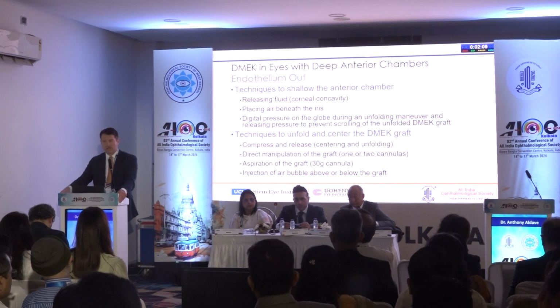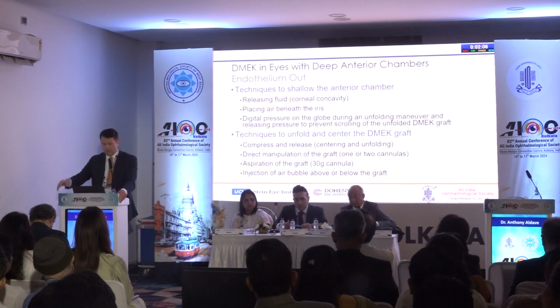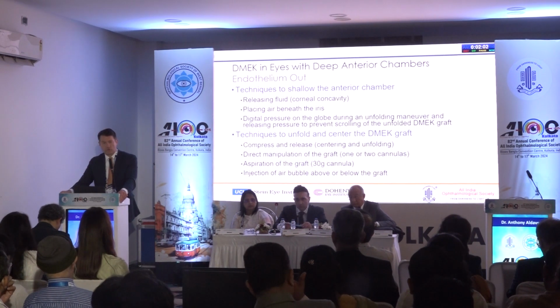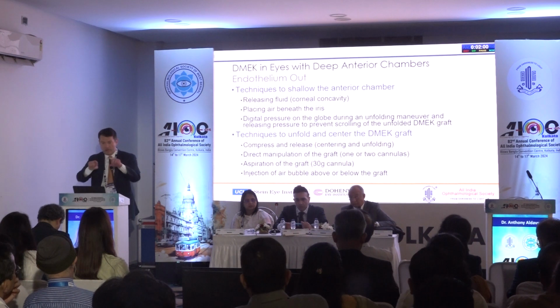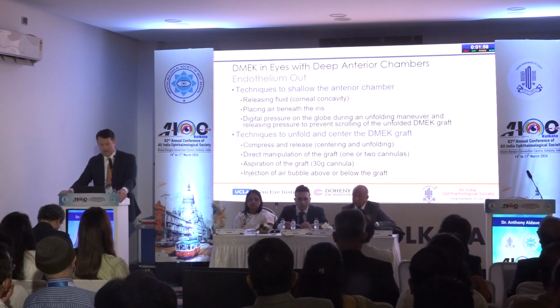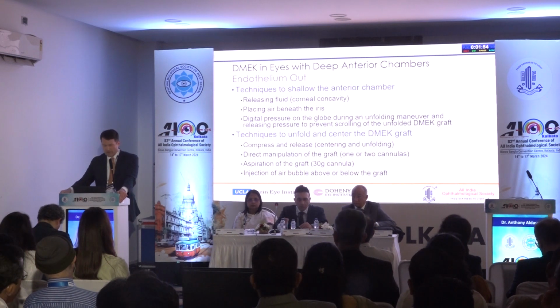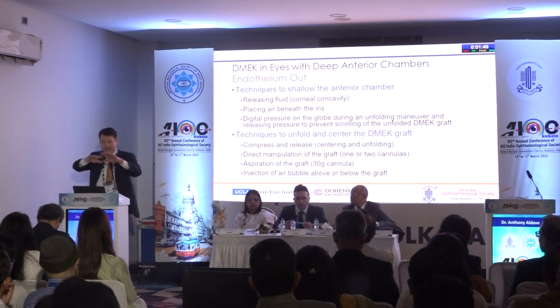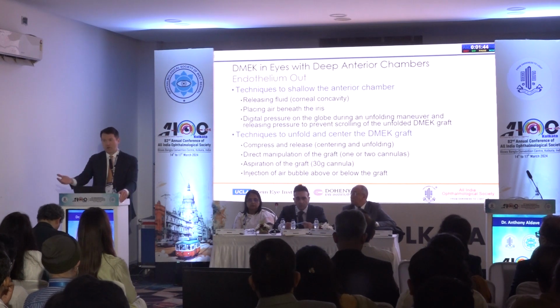Techniques to unfold and center the DMEK graft. That compress and release, the slow downward, rapid upward is one of my preferred techniques for unfolding. Direct manipulation of the graft using 1 or 2 cannulas. Some people will put in 2 cannulas and then move them apart to unfold the graft. Aspiration technique, or the vampire technique, and I didn't show you this injection of air bubble above or below the graft. If you're really struggling to unfold it, you can just put an air bubble above it, flatten it like a pancake on the iris, and then go below it and bring it up with an air bubble.